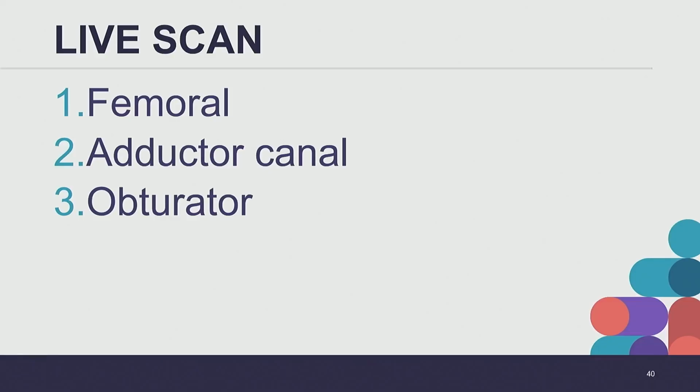Questions about that? And again, if you're only doing foot and ankle procedures, no need to target that. I just come straight down and go periarterial to get the saphenous nerve.